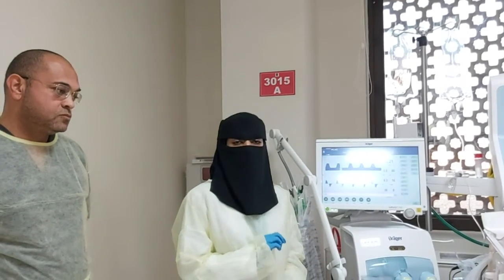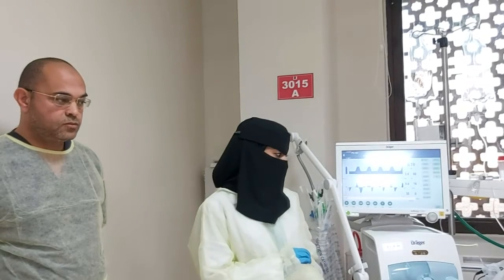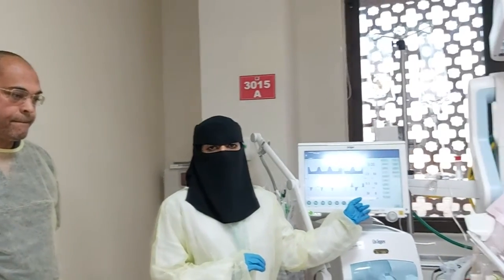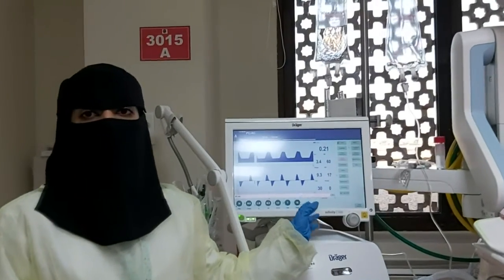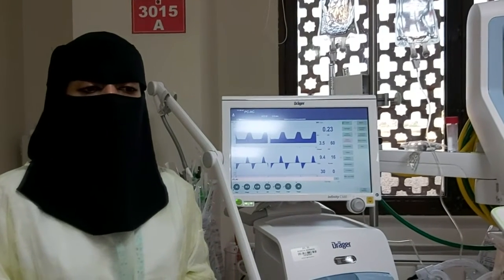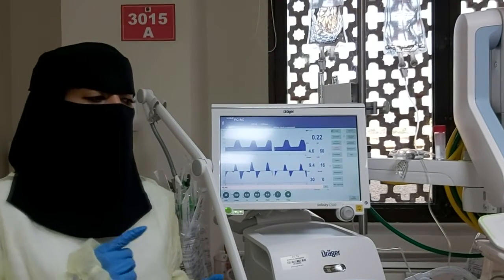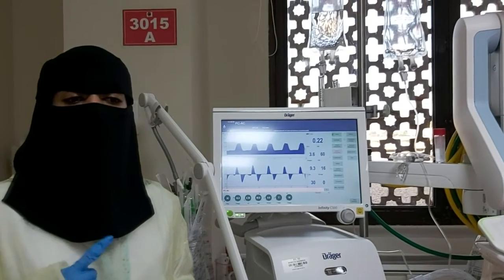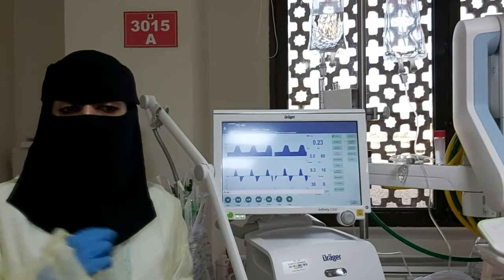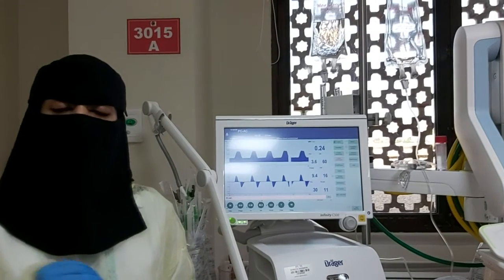Volume guarantee measures the exhaled tidal volume for each ventilator breath and automatically readjusts the peak inspiratory pressure to deliver the same tidal volume. We can add volume guarantee from the additional settings. There are many benefits: it gives us a stable tidal volume despite changes in lung mechanics or changes in ET tube leakage. It also gives us stable CO2, avoiding hypercapnia or hypocapnia.